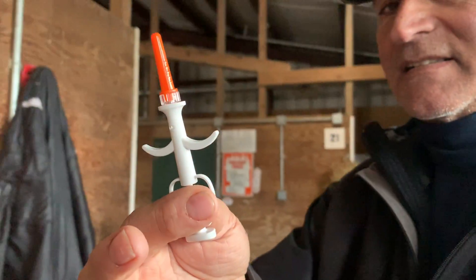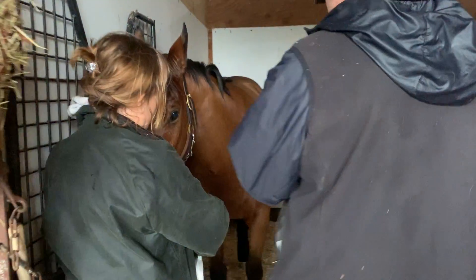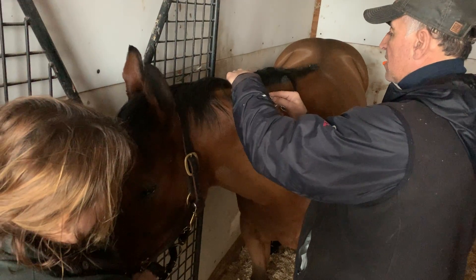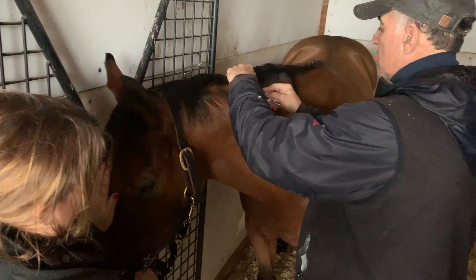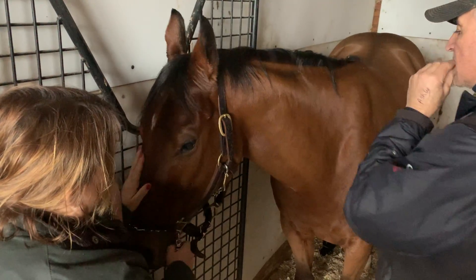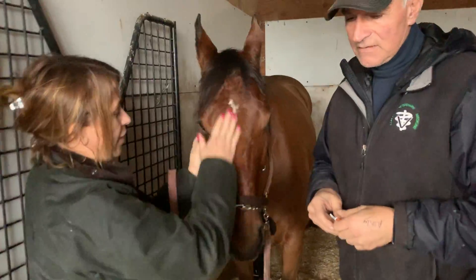It's very little. This is where he wants to stand. And that's it — easy peasy. He didn't really move a hair. And now he has a chip.